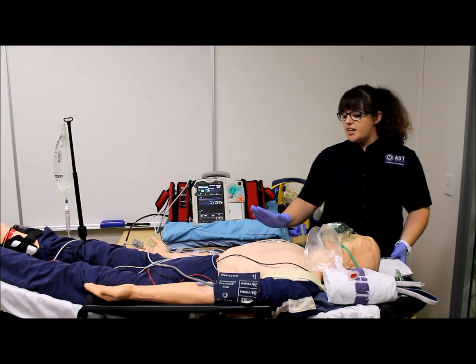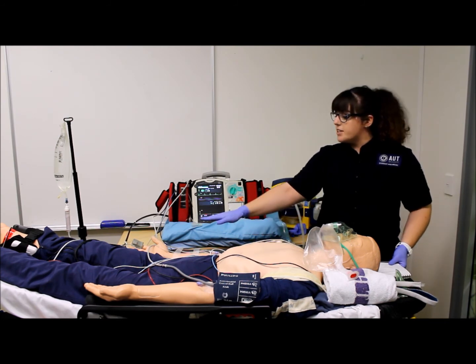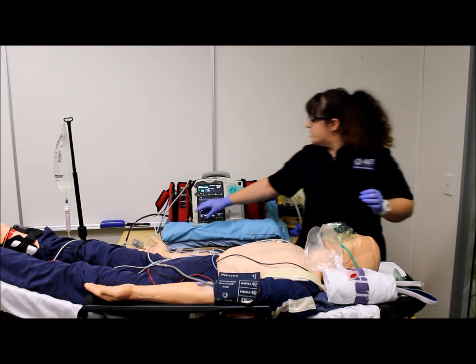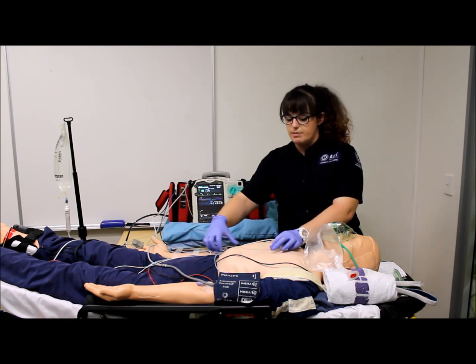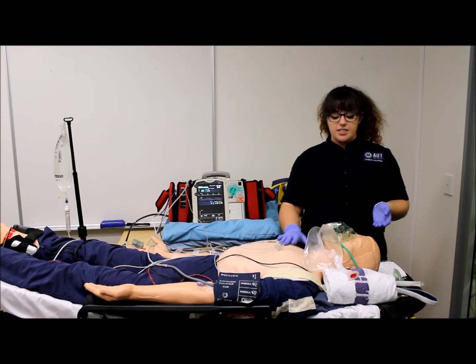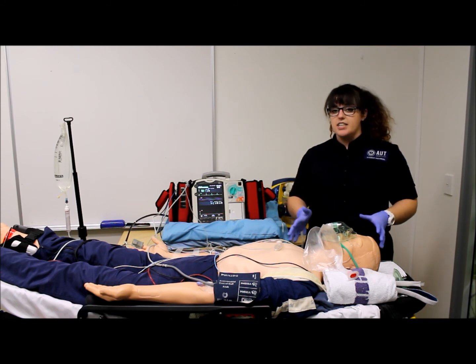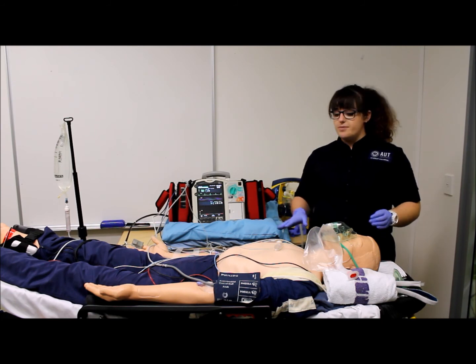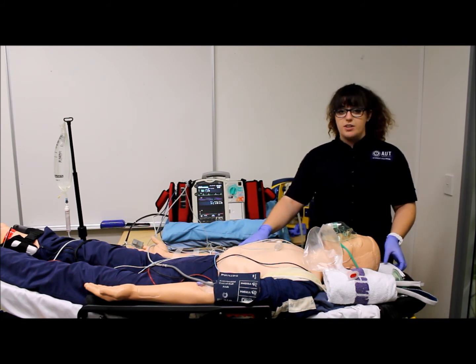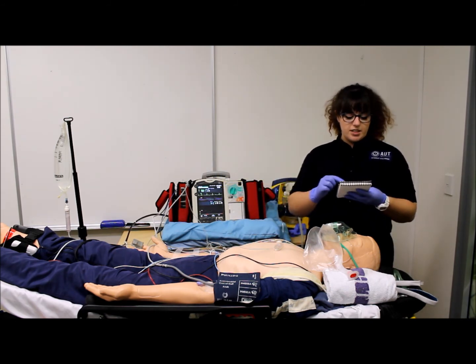We have attached our defib pads, electrodes, our blood pressure, as well as our SpO2. Next thing we want is our capnography, which is ready for when we need it. So I'm just going to place it on the chest here so that we don't forget about it. We have our monitor where we can see it, as well as a clear access on the right side of the patient for when the intubation is being carried out. We have 2 large bore IV access and some sodium chloride running, which is as per our checklist.